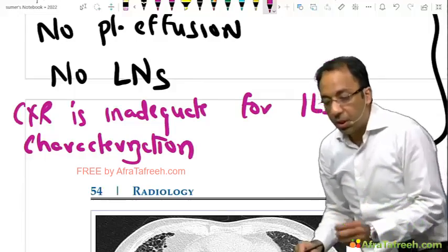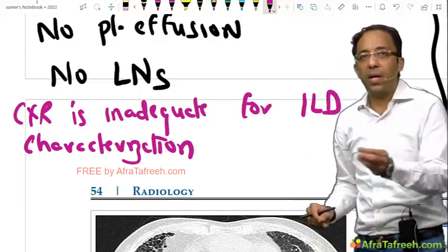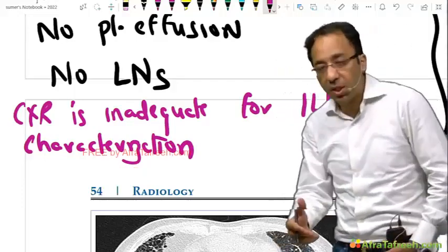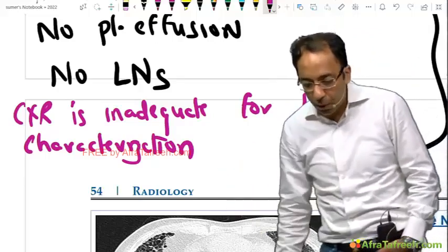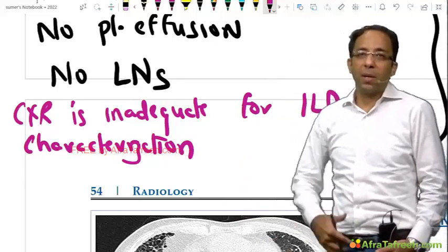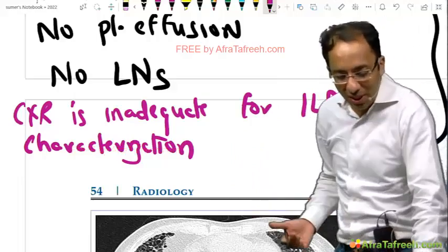Okay, I'm again repeating. Chest X-ray by itself is not enough to characterize ILD. Chest X-ray is not enough. So, microstomia, I said, was small mouth. Stomia means mouth, beta, stoma is mouth. Okay, honeycombing is a feature of a chronic process, end stage lung disease, then you will see honeycombing. So chest X-ray is inadequate.